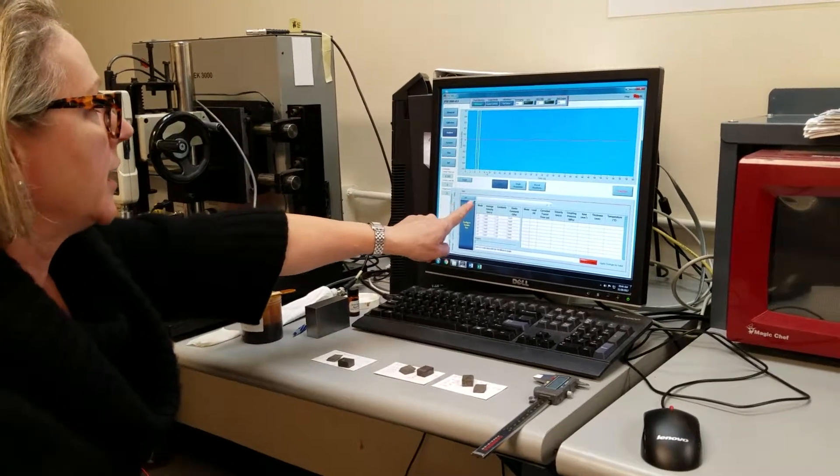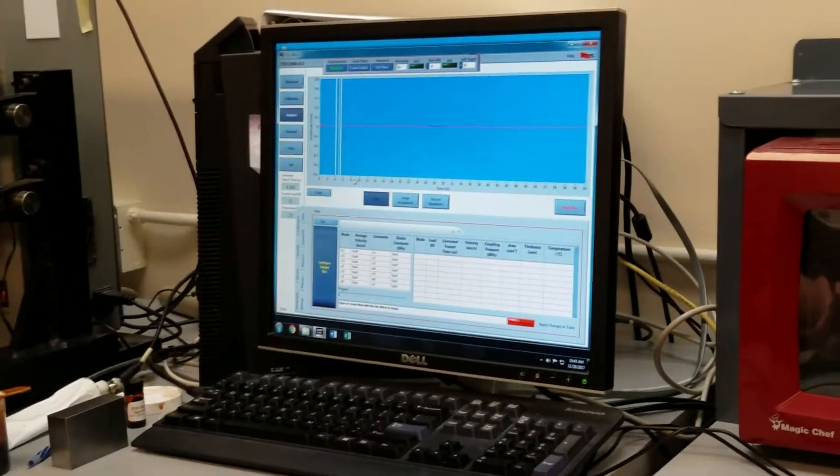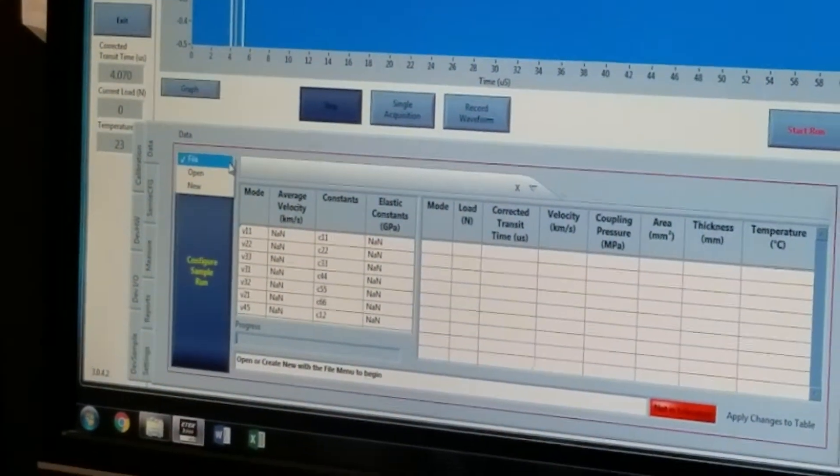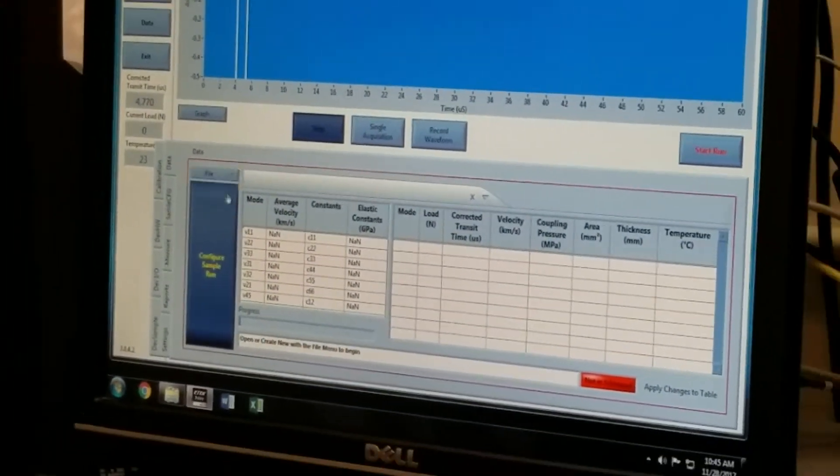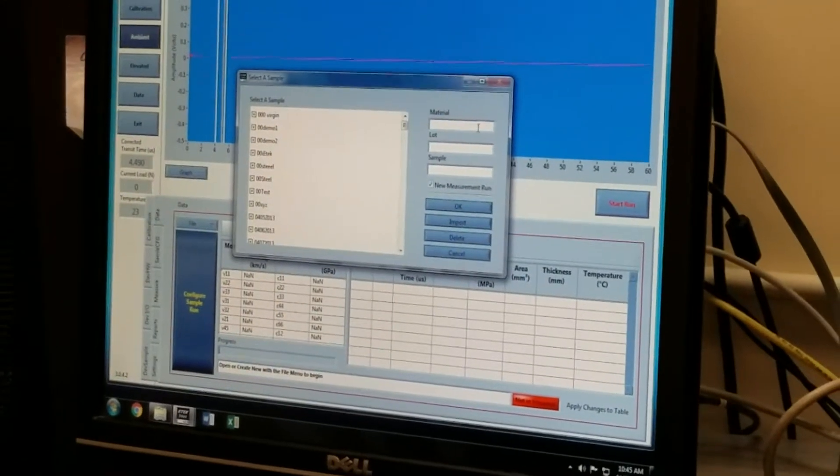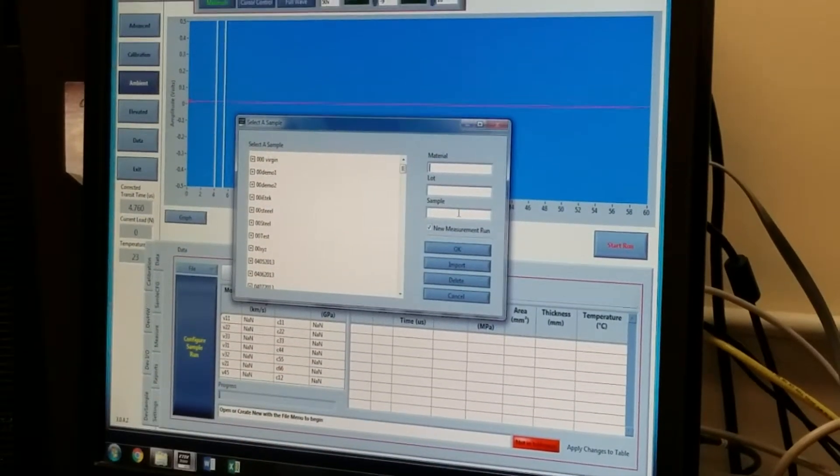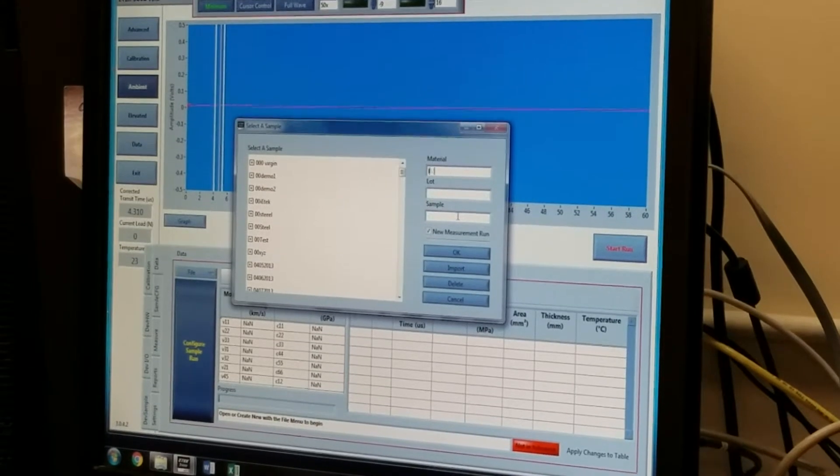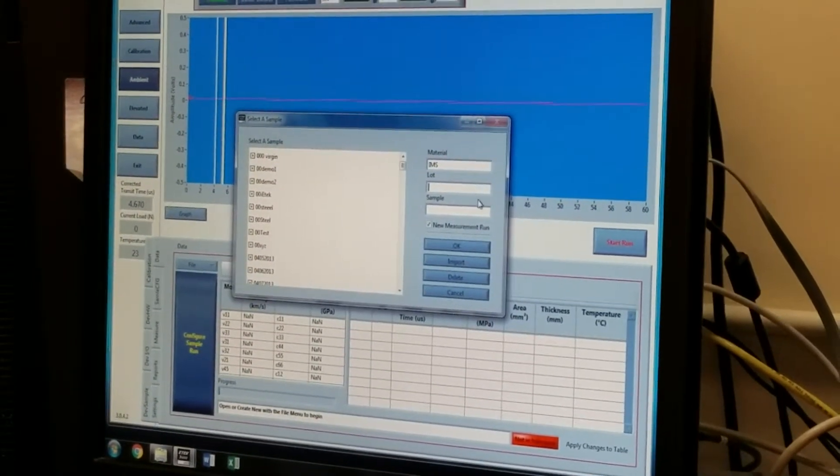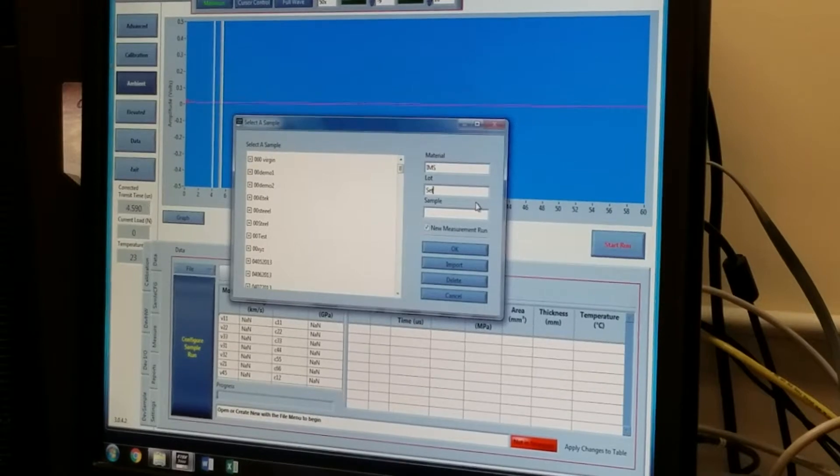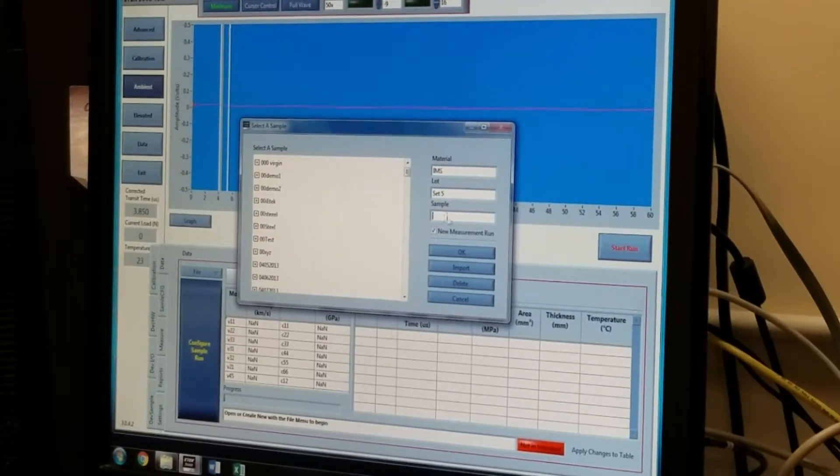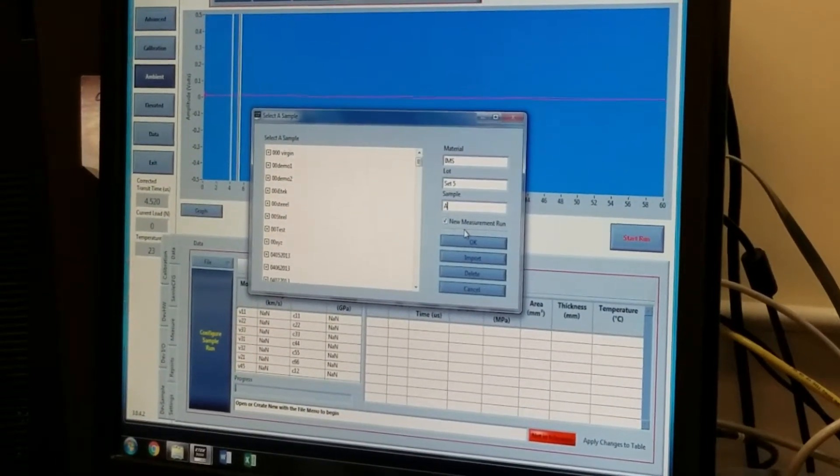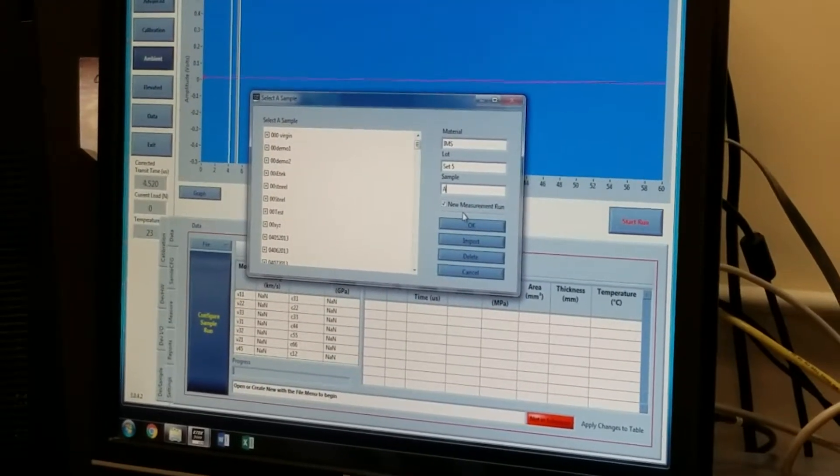On the screen, there is the word file with a little drop-down arrow, and I'm going to click on the drop-down arrow and select new, and I'm going to enter essentially a file name. So we're going to call this set of samples IMS set five, sample A, and the second and the third will be called B and C.